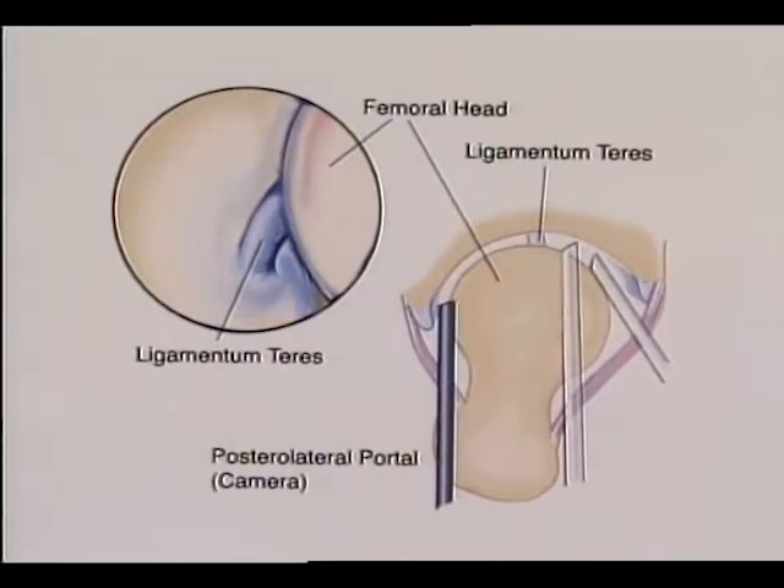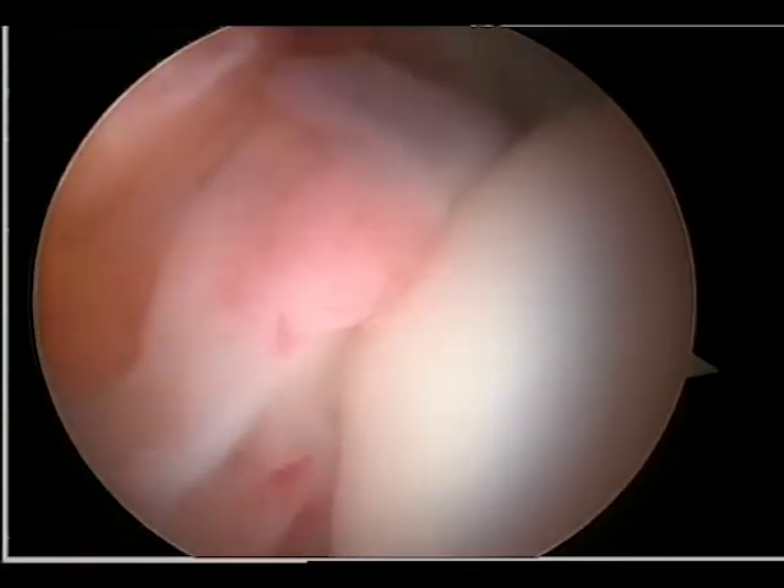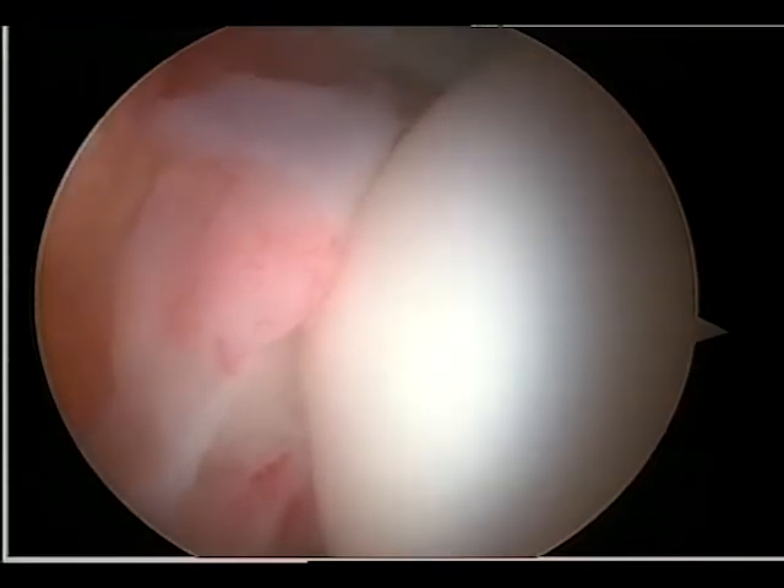The arthroscope can be readily interchanged between the various positions. The acetabular fossa, including the ligamentum teres encased in synovial folds, can be seen from all three portals with a different perspective from each.